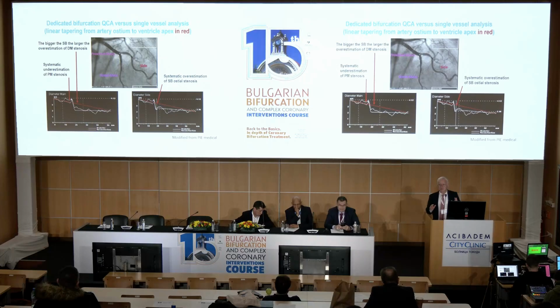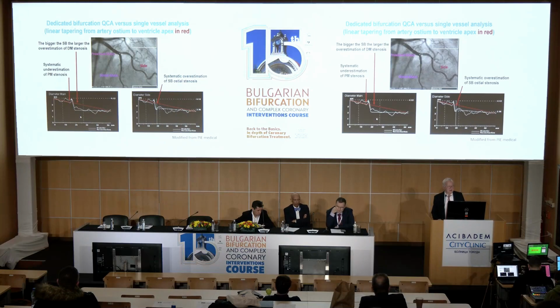After that, we tried to work more seriously on what to do. What you see at the bottom left here is proximal LAD to distal LAD. Of course, the red line is not useful anymore, but you have this reference curve, which decreases step by step at each diagonal.